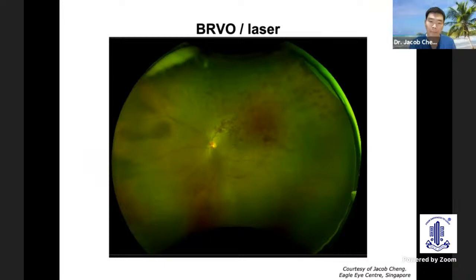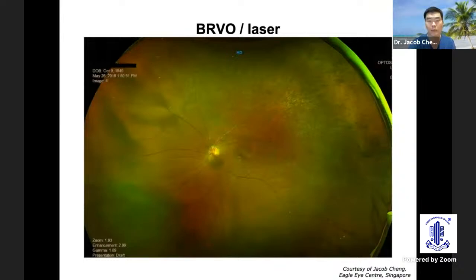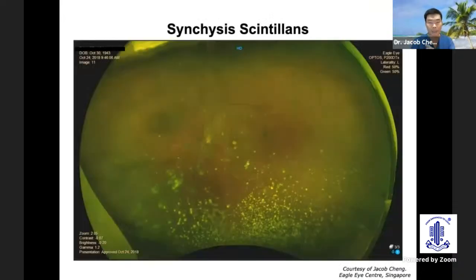Again, another patient with untreated branch retinal vein occlusion with the green laser follow-up. Again, we can see the resolution of the hemorrhages as well as the extent of the laser, again enhanced and accentuated with the green laser. How about seeing beyond the obvious? How can ultra-wide field help us see beyond the obvious? Here, we can see patients with lots of vitreous opacity.